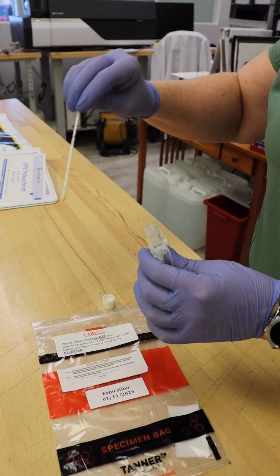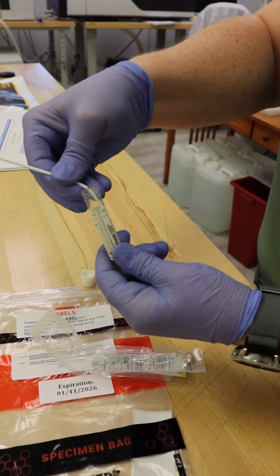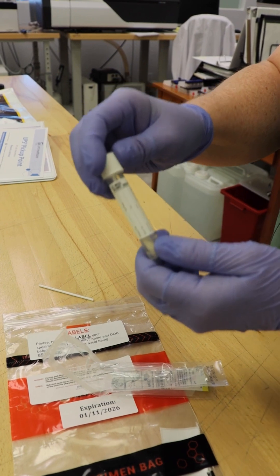Place the swab in the appropriate culture medium, snapping the swab at the break point, then screw the white cap on tightly ensuring no leaks. Make sure you label the specimen with the patient's first name, last name, date of birth, and the wound site.